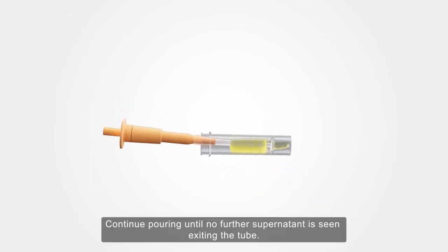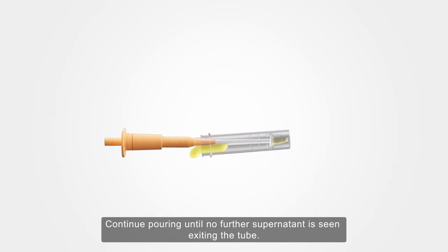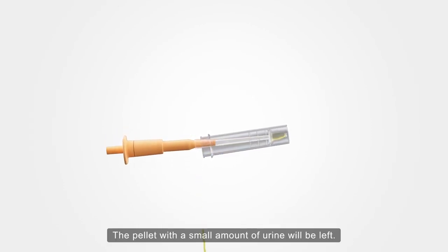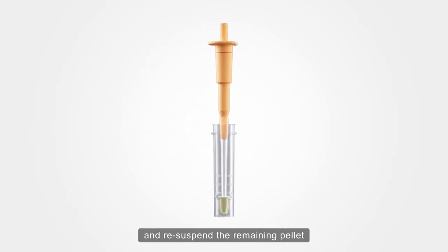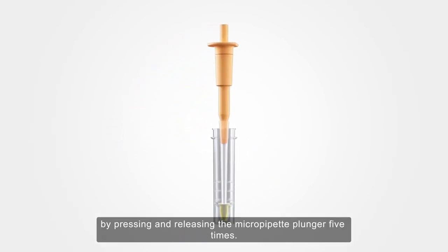Continue pouring until no further supernatant is seen exiting the tube. The pellet with a small amount of urine will be left. Return the tube to vertical and re-suspend the remaining pellet by pressing and releasing the micropipette plunger five times.